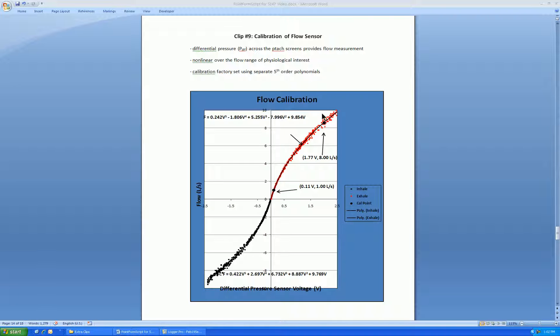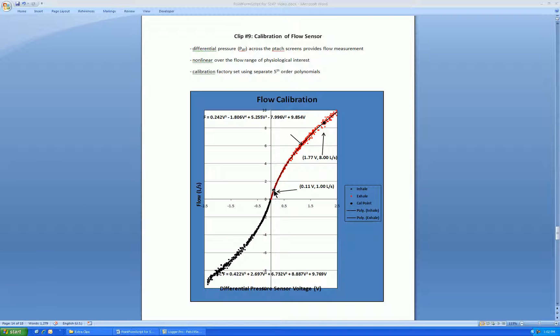For example, if you're interested in high flows in the range of 10 Lps necessary for flow volume loops in lung studies. This calibration plot here was obtained at the Qubit factory and shows the non-linearity. To it we have fitted separate fifth order polynomials for positive flow, in other words exhale, and negative flow inhale. These separate fifth order polynomials can be observed in the worksheet by clicking on the appropriate column.